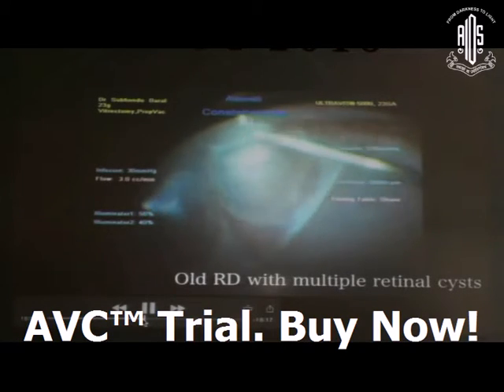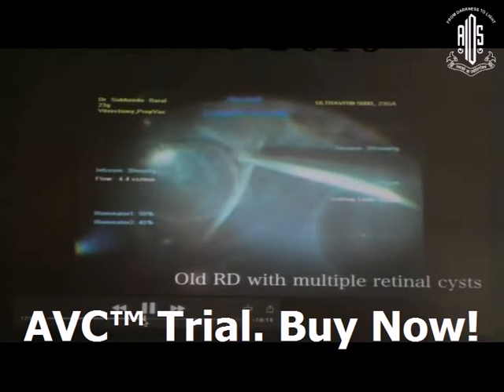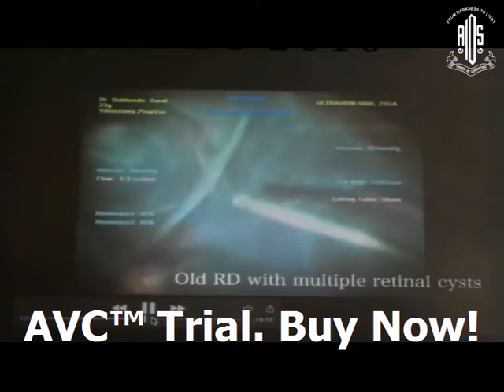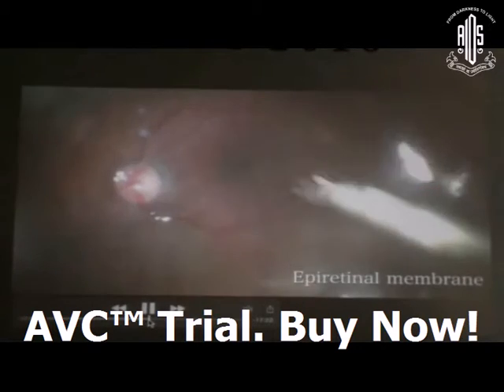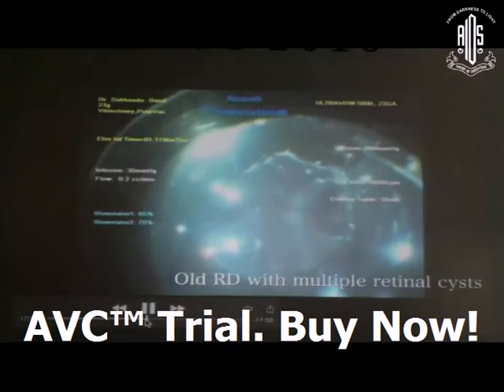Sometimes in old retinal detachment, multiple retinal cysts are present with inferior retinal contraction. Sometimes these cysts can interfere with your laser treatment.